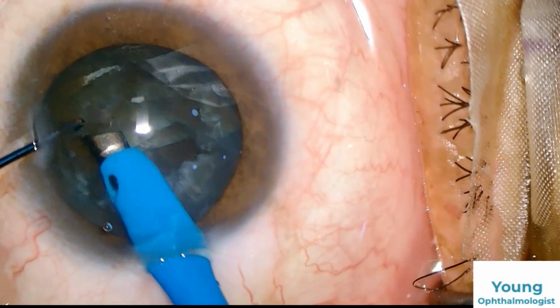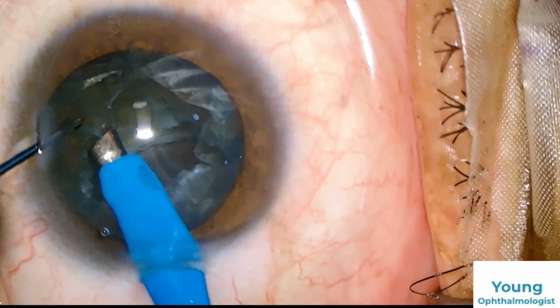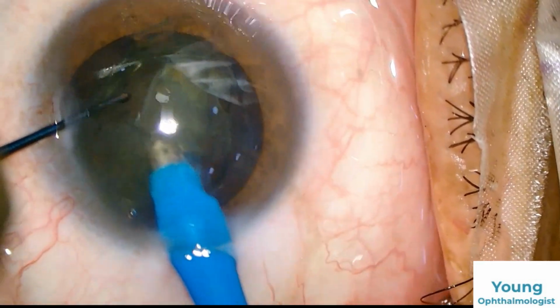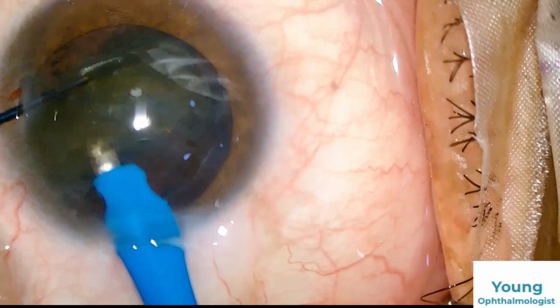This patient was diabetic, had multiple intravitreal injections, and finally when there was no macular edema, we planned for the cataract surgery. In these cases, these soft cataracts are a little bit sticky also, so you have to keep that in mind.